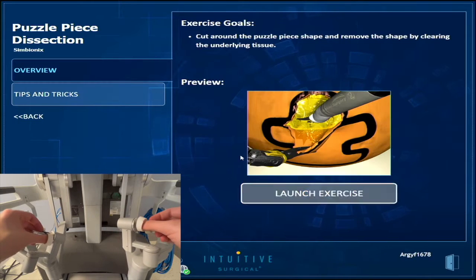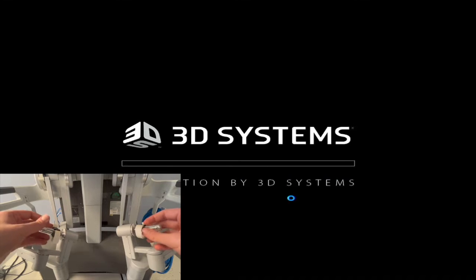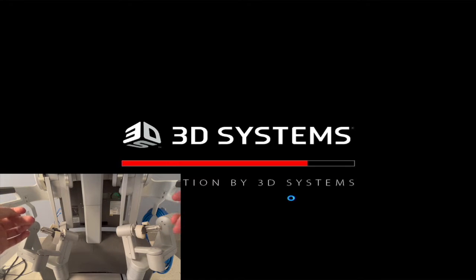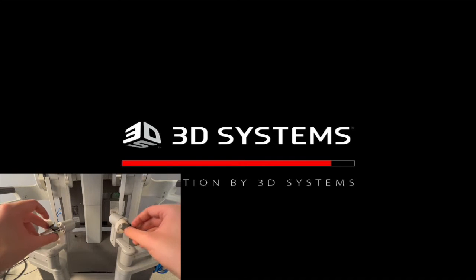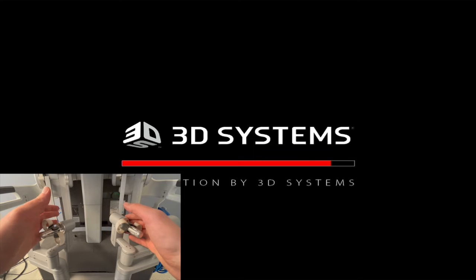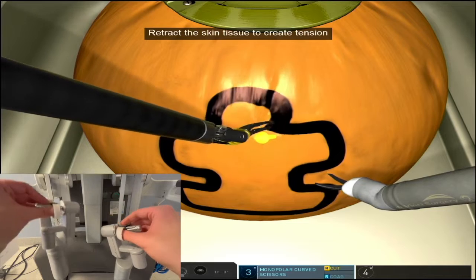Hello everyone, this is a quick video tutorial of the puzzle piece dissection exercise. I'm not personally a great fan of this exercise — I think it's unnecessarily long. However, it is one of the exercises that practices some core competencies, that being the ability to dissect a piece of tissue away from the tissue using your scissors and your graspers.